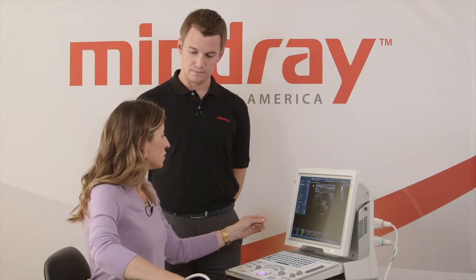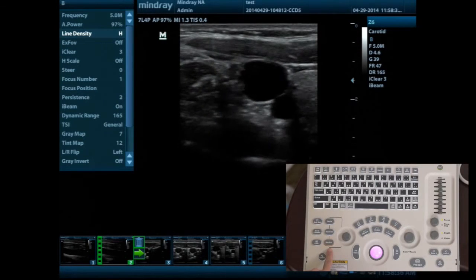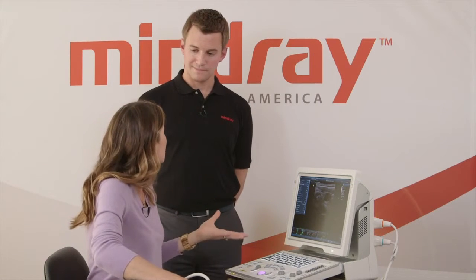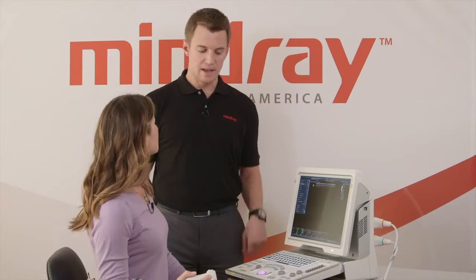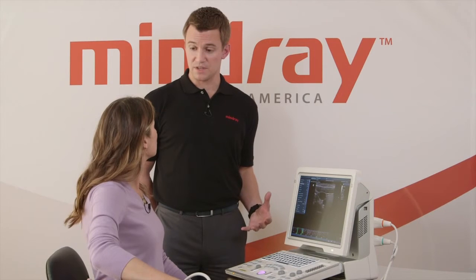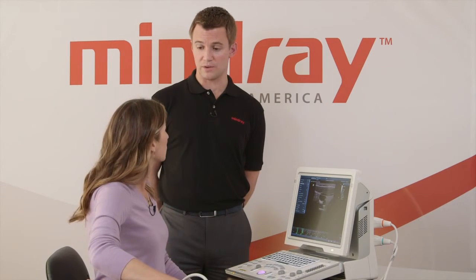So just to review, a lot of these parameters that we're seeing under the rotary navigation tool are things we may or may not want to change as we get more and more comfortable with the machine. Yeah, we can absolutely play around with those buttons. We always encourage people to, this is your machine, and we want people to use it and find out what they like and how to customize it. That being said, there are some things in each image preset, each exam preset, that are locked in pretty well for every user that's going to grab it, that they don't need to make some of those adjustments, but the manuals do a nice job of a quick reference guide. Great. As well as contacting your local sales rep and product specialist. Great.